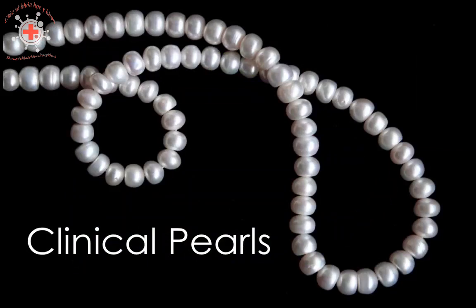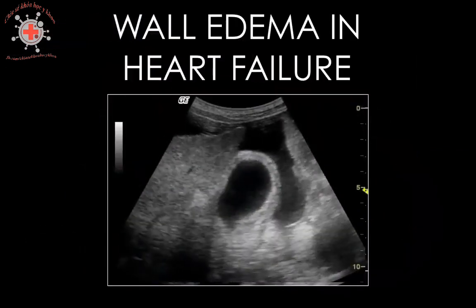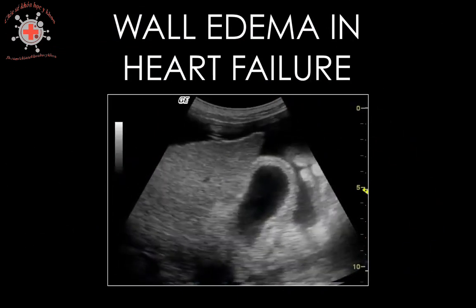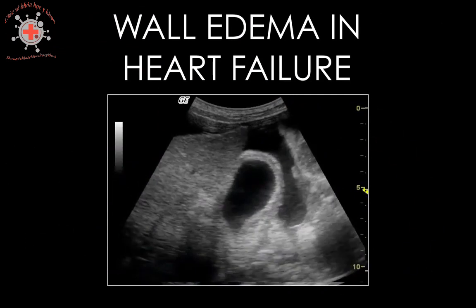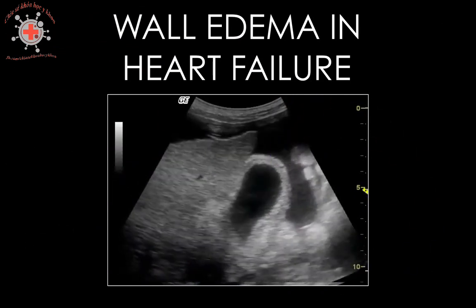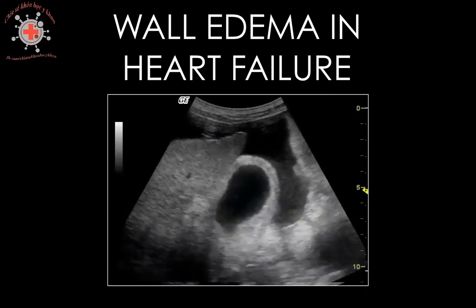Here are a few clinical pearls for biliary ultrasound. Any pathology that results in generalized edema has the potential to result in edema of the gallbladder wall. In this video of a patient with ascites, the gallbladder wall is very thick from edema. This is sometimes difficult to differentiate from a gallbladder with an inflammatory process.